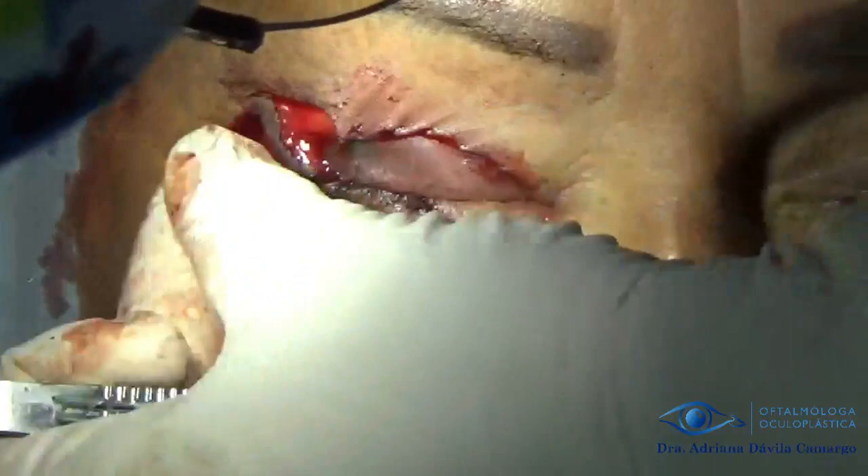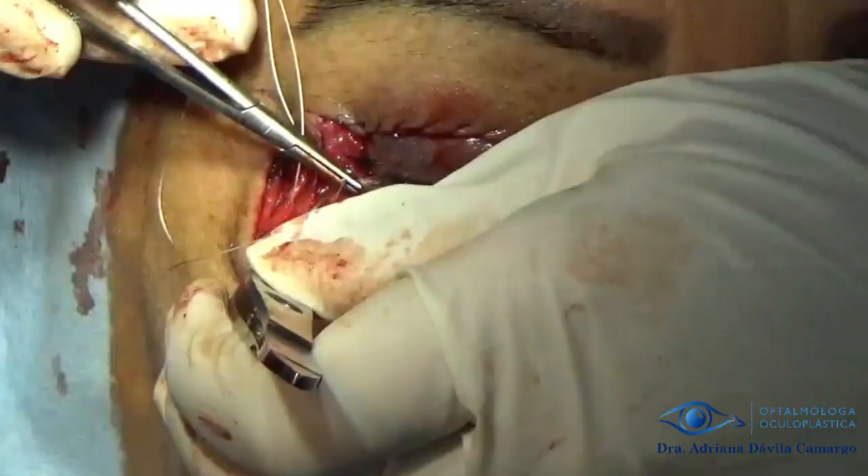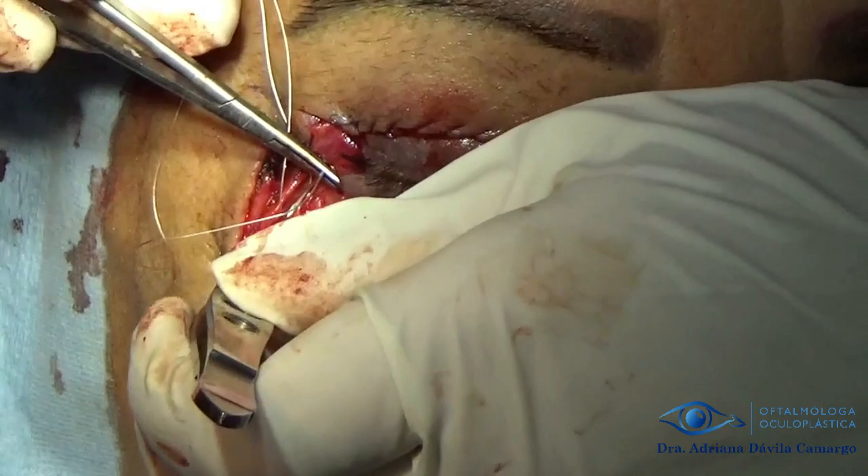We close the upper eyelid with 6-0 prolene and give some stitches in the periorbital periosteum to lift the cheek so that it has support in the periosteum. We give some deep stitches with Vicryl 4-0 to support the cheek. Here we are giving sutures to the periosteum and later to the muscle, and in this way we traction and support the cheek. We perform several of these sutures along the defect, which reduces our defect.